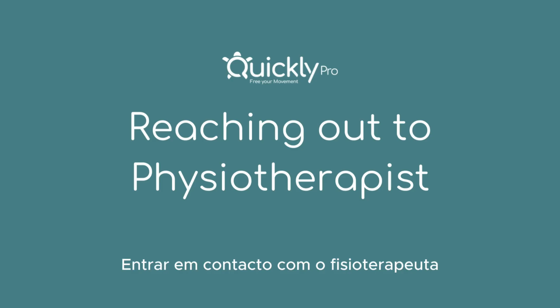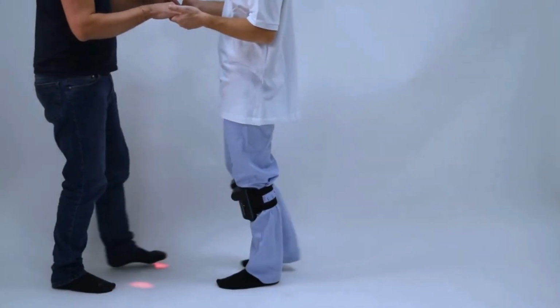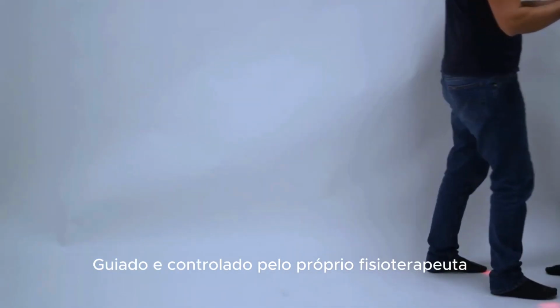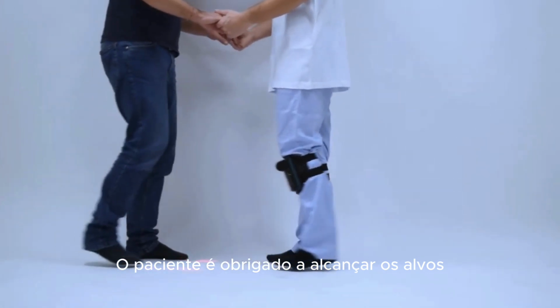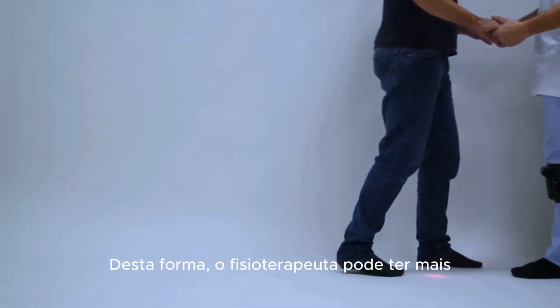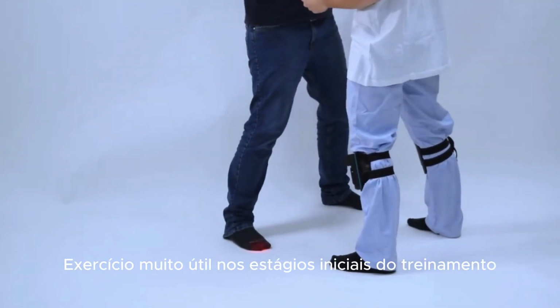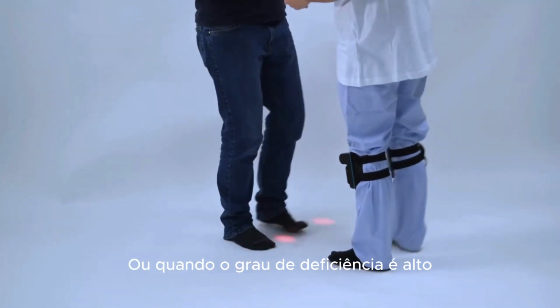Reaching out to physiotherapist. It is also possible to use Q-walk worn by the physiotherapist to perform exercises in training guided and controlled by the physiotherapist himself. The patient is required to reach the targets generated by the physiotherapist's movements. In this way, the physiotherapist can have more control and guidance over the patient's movements. Very useful exercise in the early stages of training or when the degree of impairment is high.